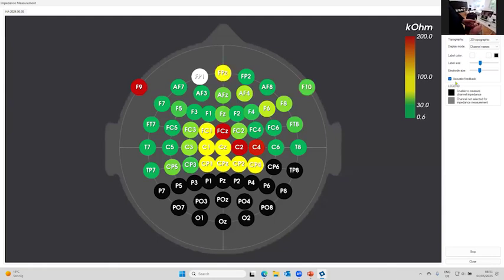So again, we are moving away a bit here, and then we inject the gel. So you see this electrode is also floating away. You can see by the movement of the cap here that the electrode is over here. So I will inject again a bit more gel, and I'm looking for it to cover the electrode like that. And with that, we almost have everything ready.